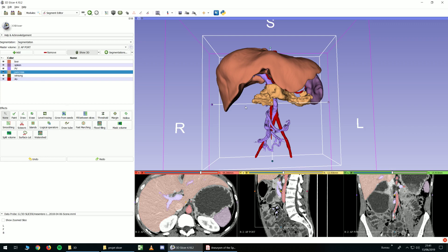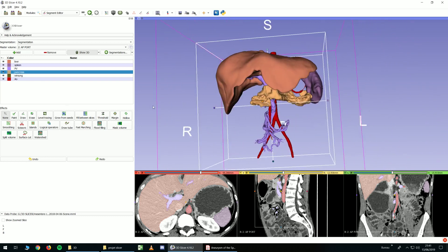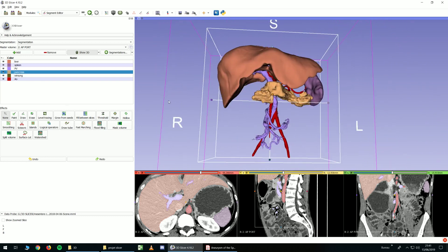Hello, in this video I will show you how to create models with 3D Slicer and how to export them.